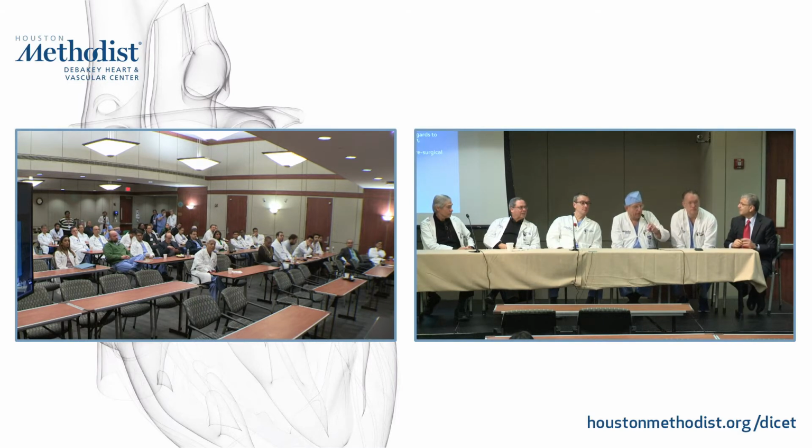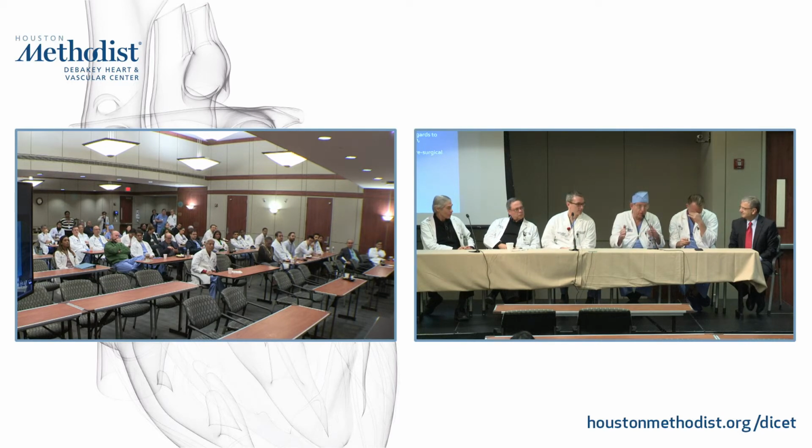In a normal valve, the vortex is clockwise, looking from the apex, and in these prosthetic valves, it's counterclockwise. So you get this thing projecting right up under the valve. The leaflet should open fully, but the leaflet motion may be slightly delayed. You'll see instead of doing that, you'll see one leaflet just slightly lagging.